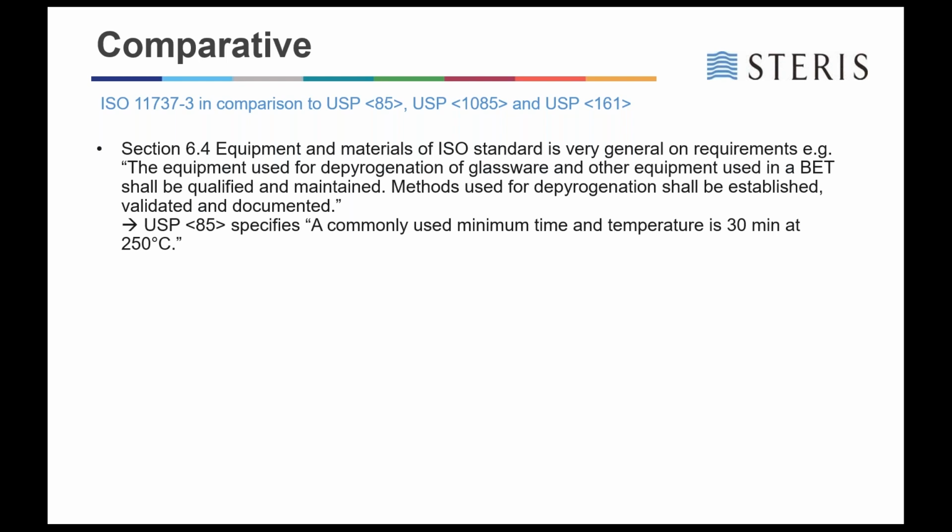Here, USP 85 would give you more detailed, very specific guidance. For example, it is stated in there that a commonly used minimum time and temperature for depyrogenation is 30 minutes at 250 degrees.